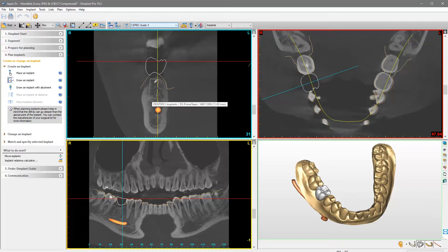In this case, Simplant Pro has been configured with DensaSply Sirona Prime Taper as its default implant. Use the diagnostic setup included as a reference to set the angulation, and when choosing the implant length, aim to be 2 mm away from the nerve canal. To define the length in buccal-lingual angulation, we move the mouse apically. We left-click to establish the position of the implant apex.